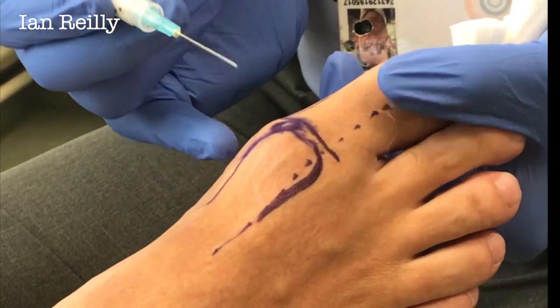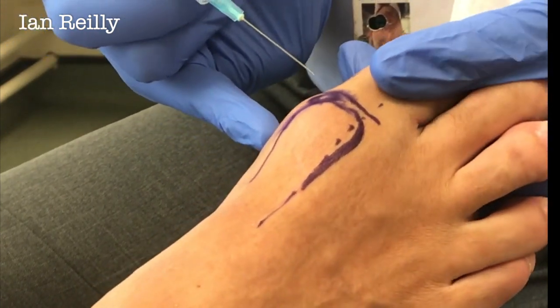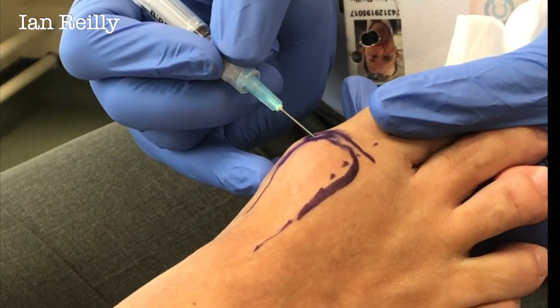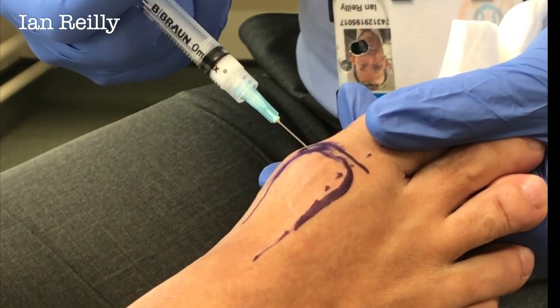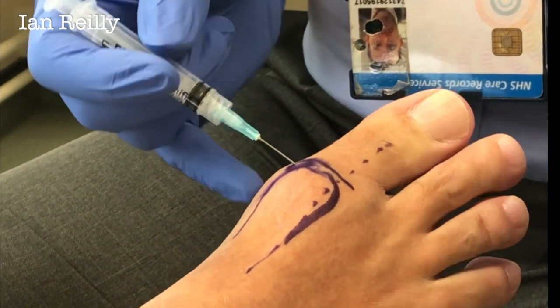James, are you sitting comfortably? I think so, yes. So we are going to plantar flex and distract the joint. 3, 2, 1, scratch. Little sting there. He's just pulling a face. In fairness, he was pulling a face when he came in — that's just how he looks. Finished. Well done, your man.